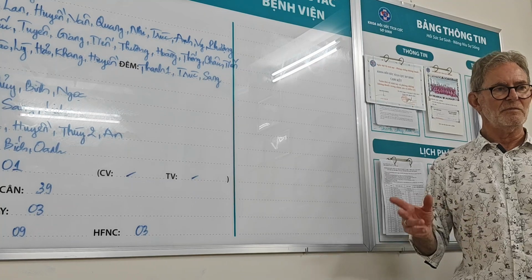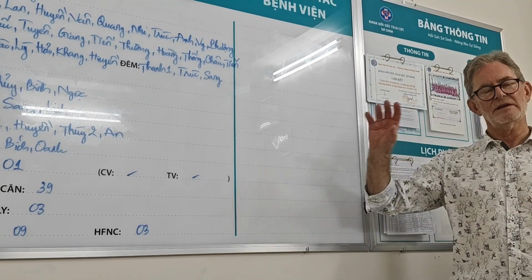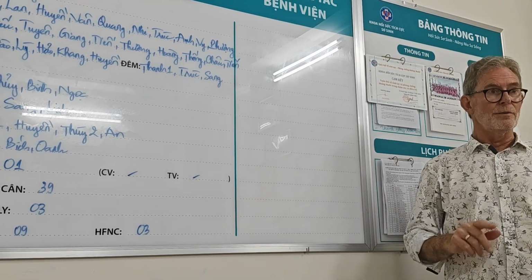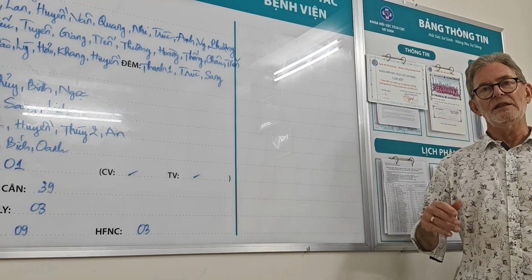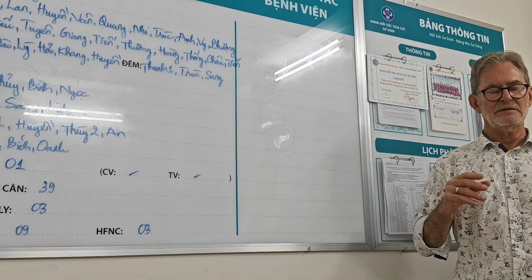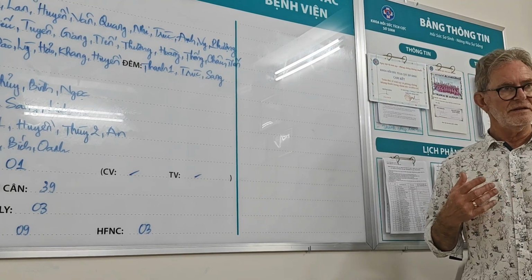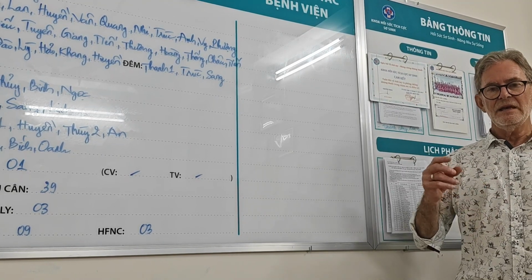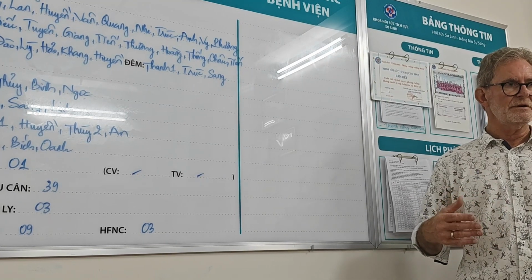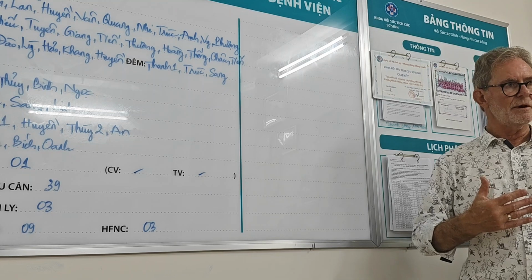And one of the things you have to be careful of when you swap a baby from conventional ventilation to high frequency is sometimes the CO2 can drop really, really quickly. And you don't want that because the premature baby's brain circulation is very CO2 sensitive, and if you have very low CO2s for longish periods of time, you actually restrict blood flow to the brain.